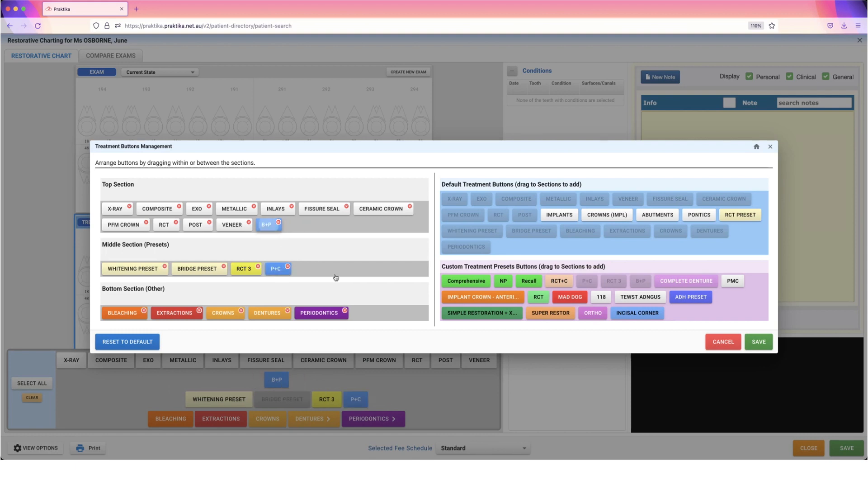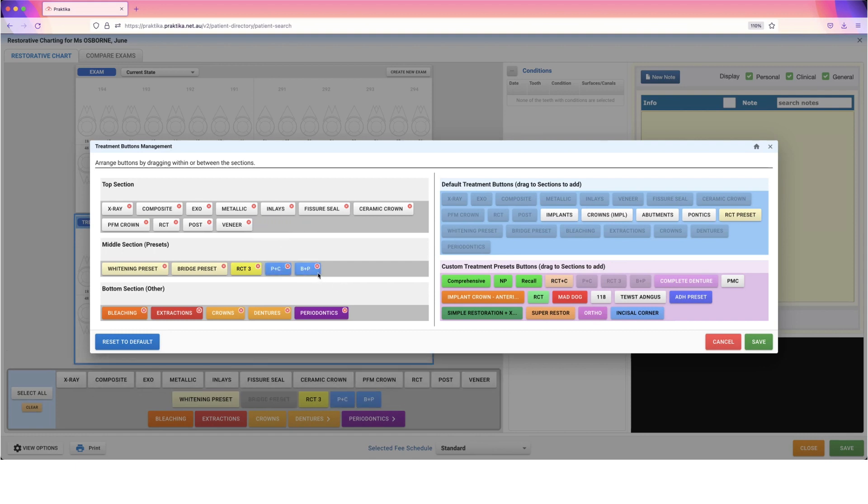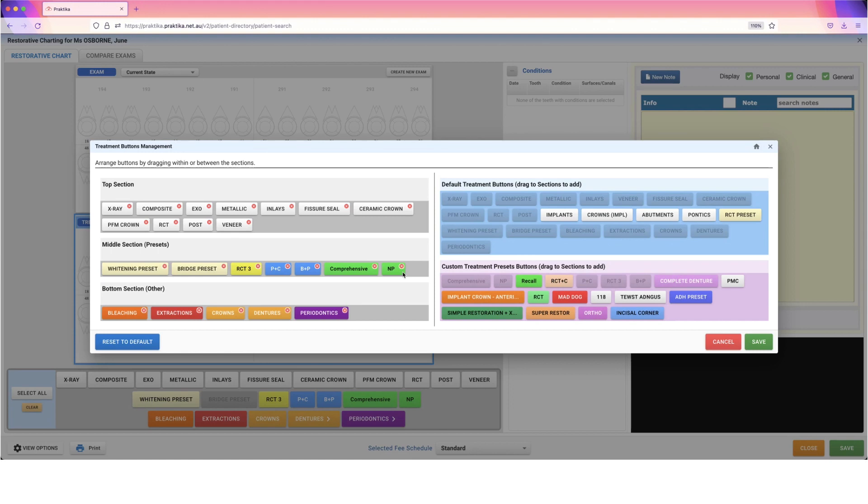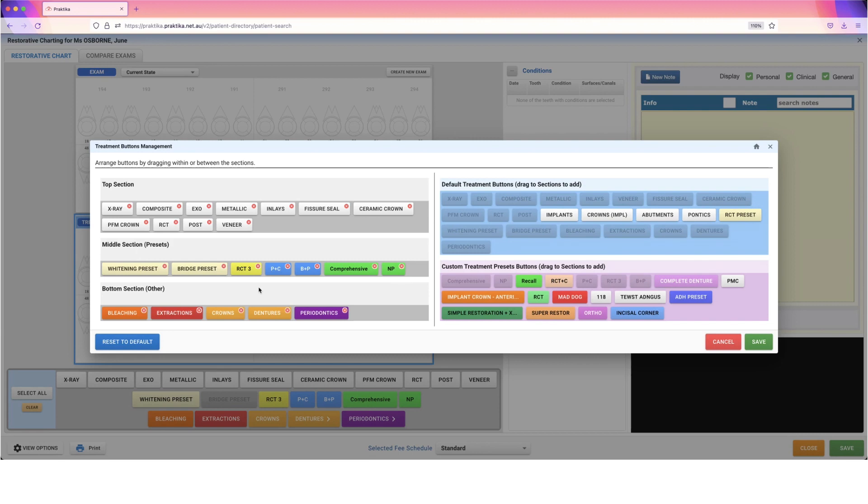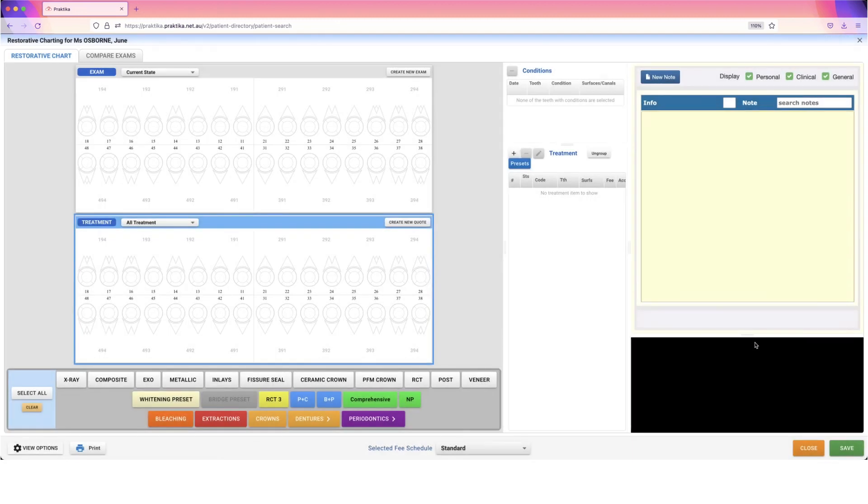Lay this out however works best for you. The thing to remember is anything you do in this space will only affect you. Any other users within the practice will have the ability to do this for themselves. If you want to show root canals, crowns, go for it. If you have hygienists who don't need those options but want periodontal options instead, they can do that. Everyone has a unique view. When we're happy, press save.